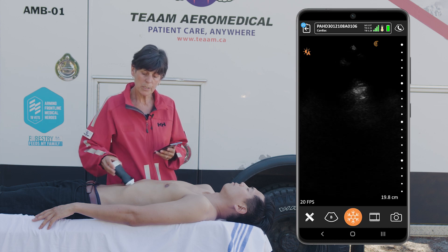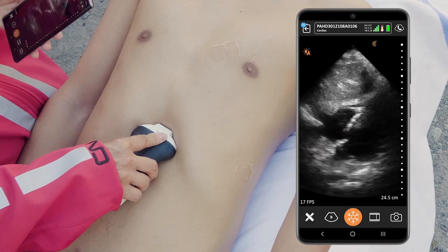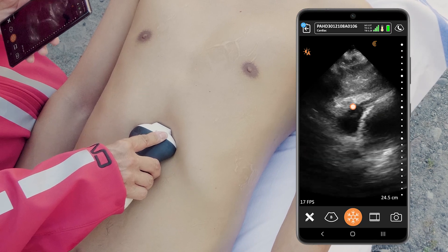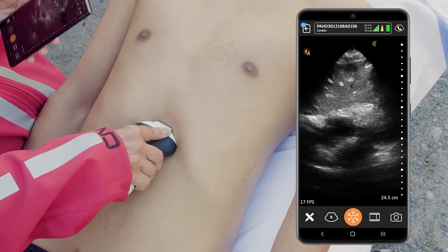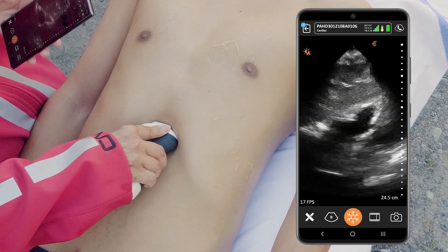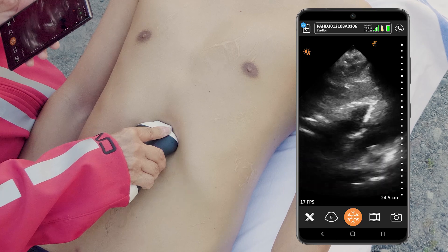Now I'm going to move down to the sub-xiphoid window, which is another great view for looking at the right side of the heart because it's closest to the scanner. This is a fantastic view for looking for pericardial effusion, even little tiny trace amounts. I'm just going to sweep back and forth anteriorly and posteriorly to make sure that we've gone through the whole area of the pericardium.